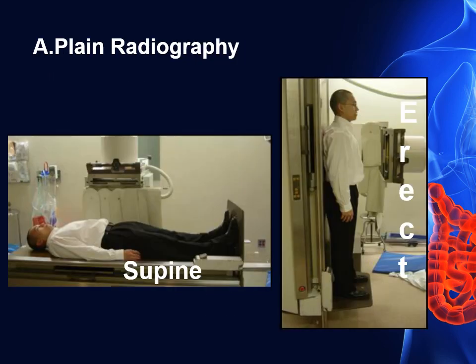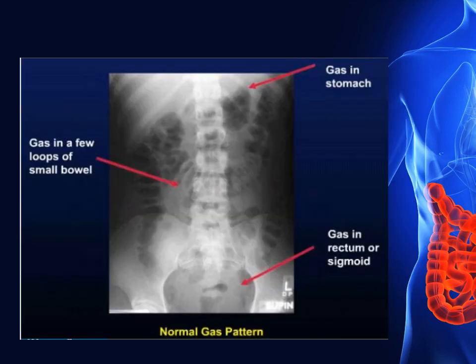On plain radiography, as you can see, we have two positions: supine and erect. Here is the gas distribution within the abdomen. We have gas in the stomach in the left hypochondrium and the inverted U-shape with characteristic haustration at the periphery of the abdomen representing the gas of the colon, and a few loculi of air in the center of the abdomen resembling gas in the small bowel loops.